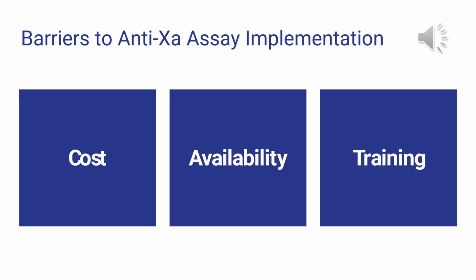In regards to barriers to the anti-Xa assay implementation, while the research that I presented does support the use of anti-Xa assay, implementation at the hospital level remains inconsistent. The cost and availability of anti-Xa assay can be a barrier to widespread adoption, and healthcare providers may be unfamiliar with the new monitoring technique, necessitating training and education. However, given the promising evidence of better clinical outcomes, transitioning to anti-Xa monitoring could be a valuable investment in improving patient care.